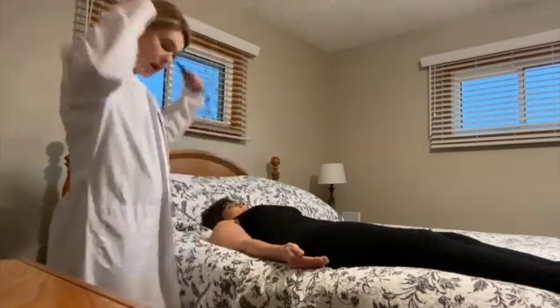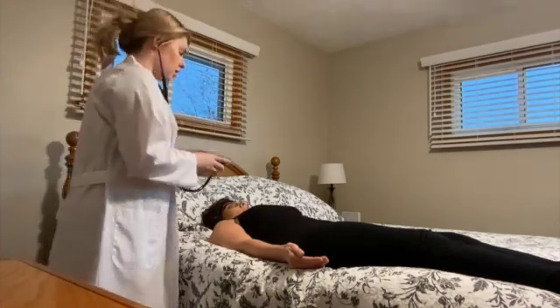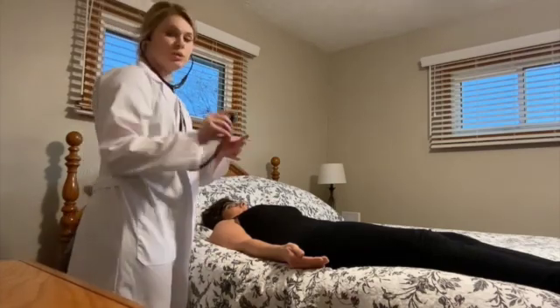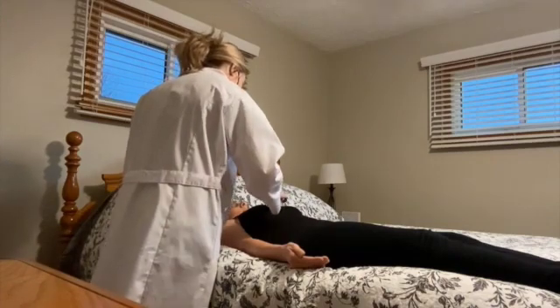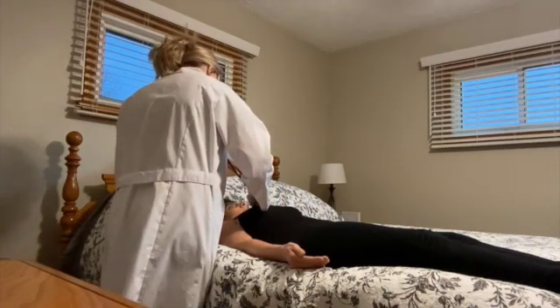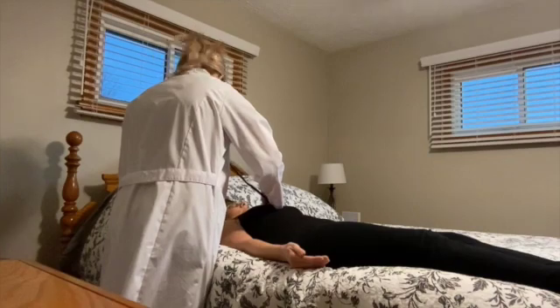Okay. So now I'm going to begin auscultating the heart. I'm going to start out with using my diaphragm just to listen to any heart sounds. Going to start at the aortic. The pulmonic.